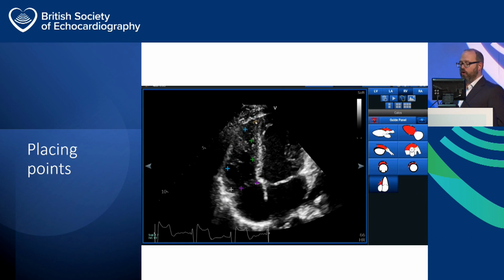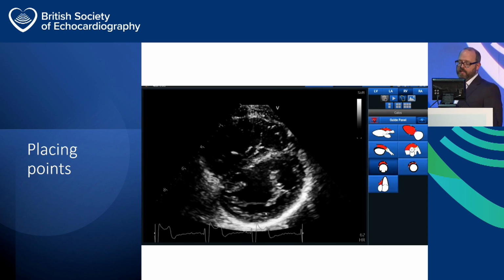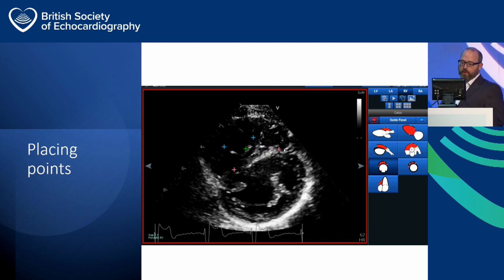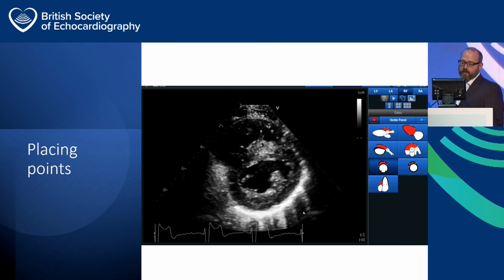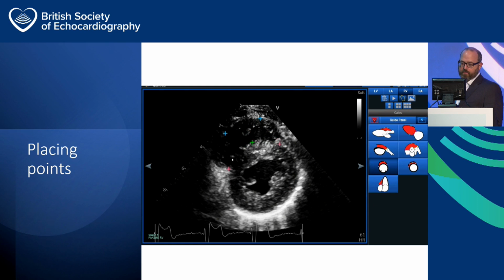And you do this on multiple acquisitions. So the next frame we come to, we'll go for a short axis view. Again, this is a short axis view focused on the right ventricle. We pull across our template for our short axis view, where we can mark off again. We've got septal points, we've got anterior wall points, and these are markers which demonstrate the edges of the septum, just as the right ventricle is inserting into the edges of the septum before the left ventricle. We mark off these points here. I've not shown you all the windows we do this on, but for a right ventricle, you take around about 6 acquisitions.